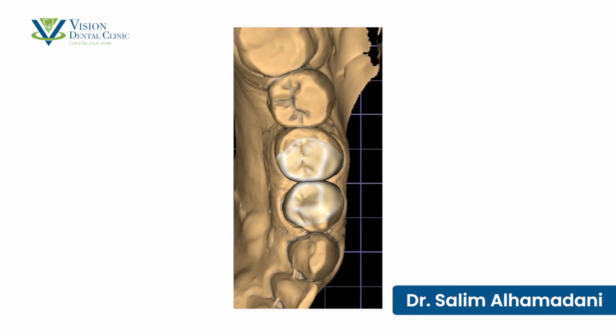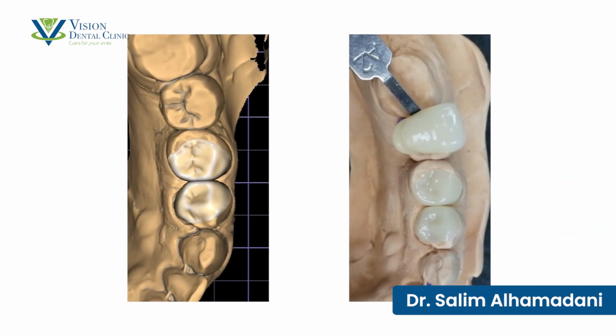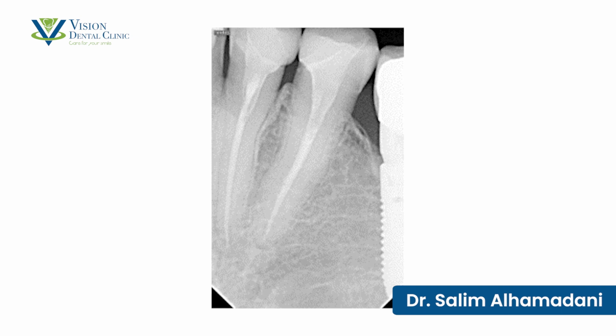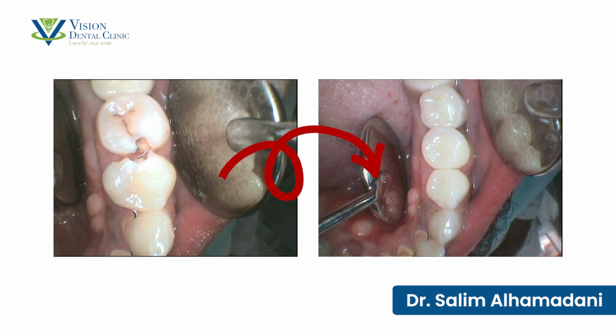To ensure the quality, CAD/CAM restorations were designed and checked by our lab technician in collaboration with Dr. Huzian. High-quality CAD/CAM restorations were delivered to the patient's teeth to ensure proper bite and teeth relation, avoiding food impaction, and finally an amazing natural look.